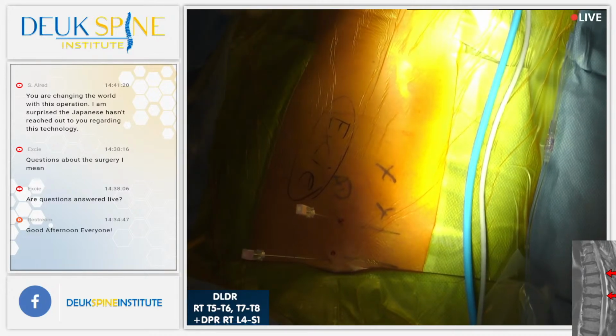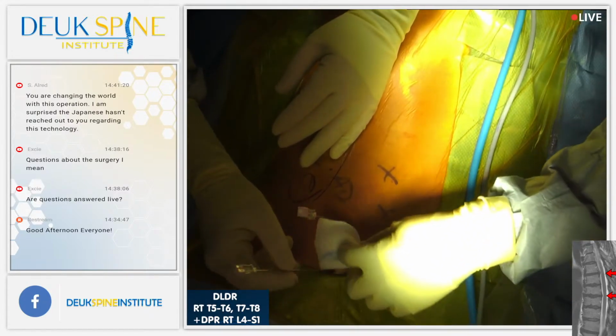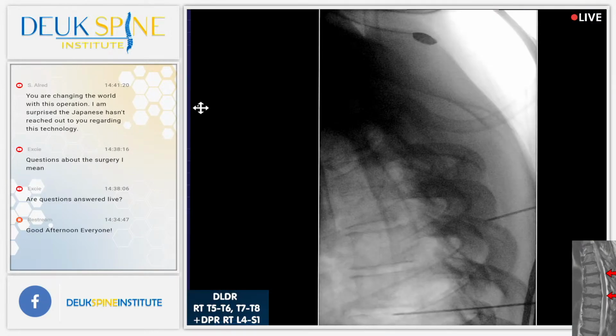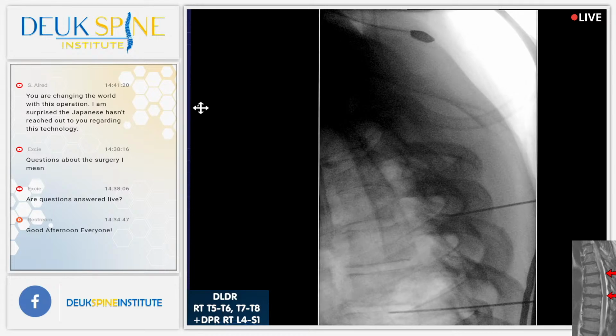All right. So we're literally at the top of our incision, and this is where the other disc is that we agreed to treat. Shot? You're doing great, by the way. Hang in there, okay? We're almost done with the hard part, with you being awake. Shot? I could feel the facet, and I want to go just lateral to the facet. Yeah, I know. I apologize. That's uncomfortable.